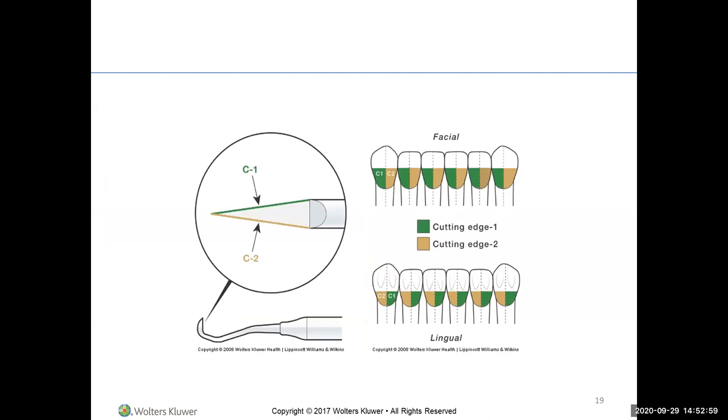For seating positions with anterior teeth, do the surfaces toward you first, then swing to the 11 or 12 o'clock position for surfaces away from you. When seated at 9 o'clock doing surfaces toward you, you're using cutting edge one. For surfaces away, you use the other cutting edge. One side is the facial, the other is the lingual.